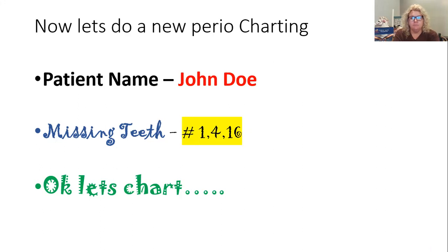Where am I? Now this is where we crossed over the midline. So look again. You should have said mesial buccal of 23. 2, 1, 2, 2, 2, 2, 2, 1, 2, 2, 2, 2, 2, 2, 3, 3, 3, 3, 3, 4, 4. We should be coming around.